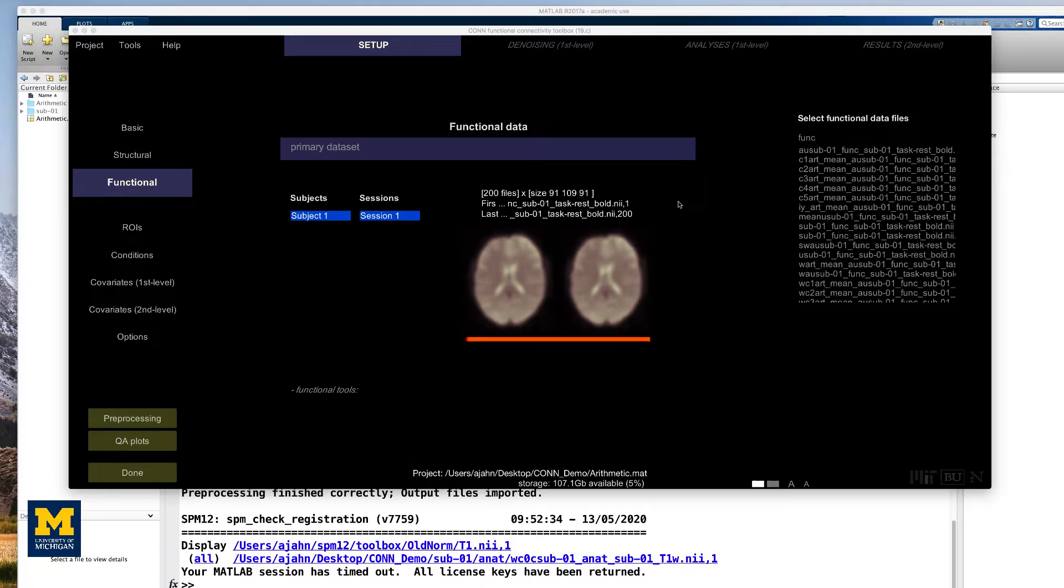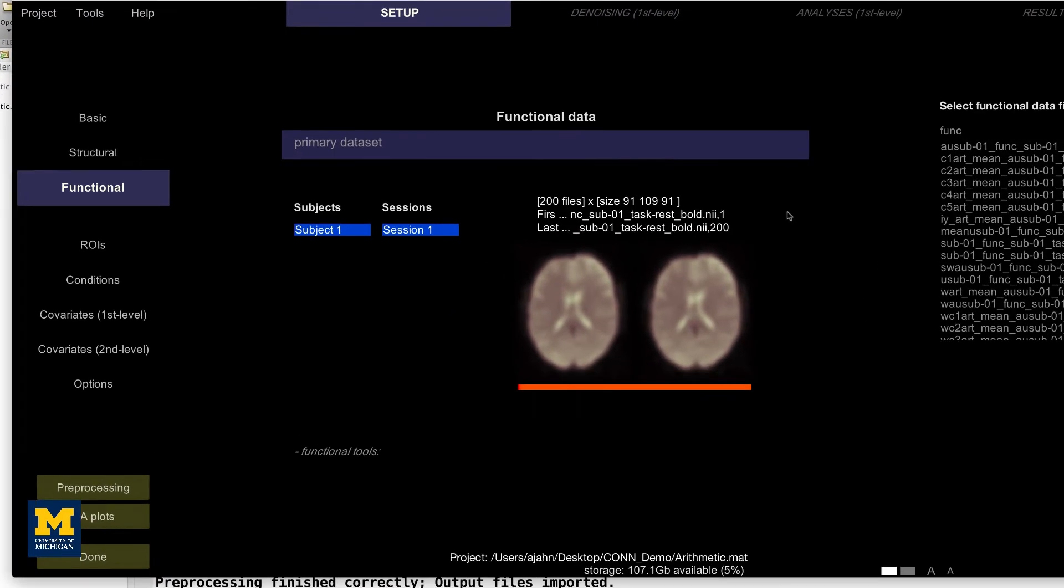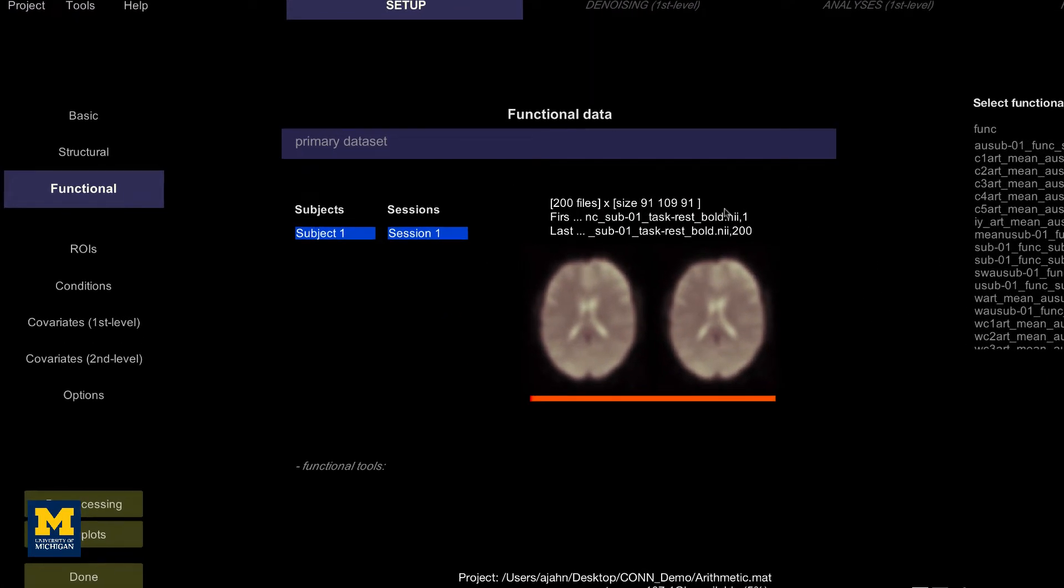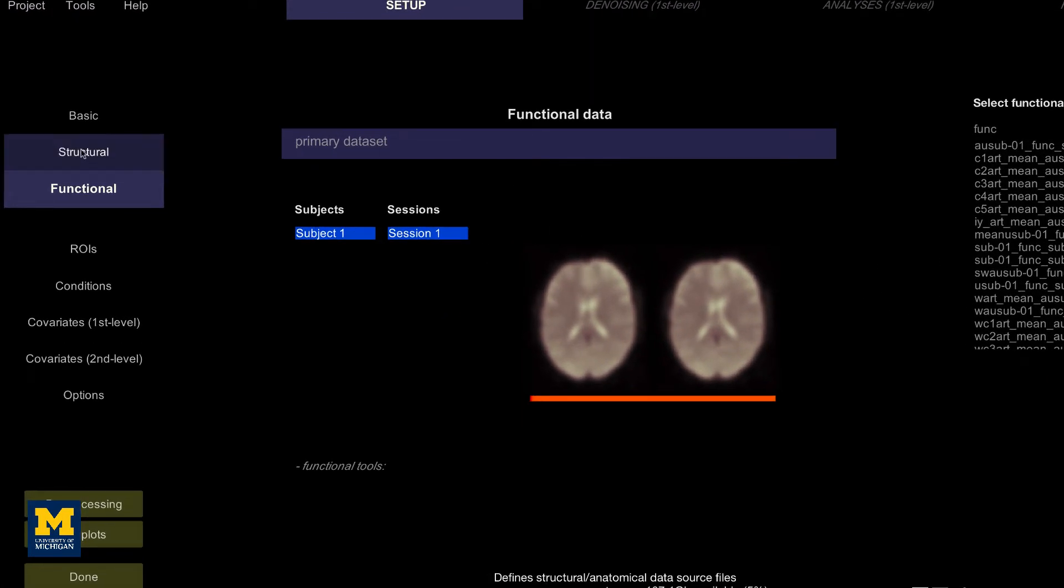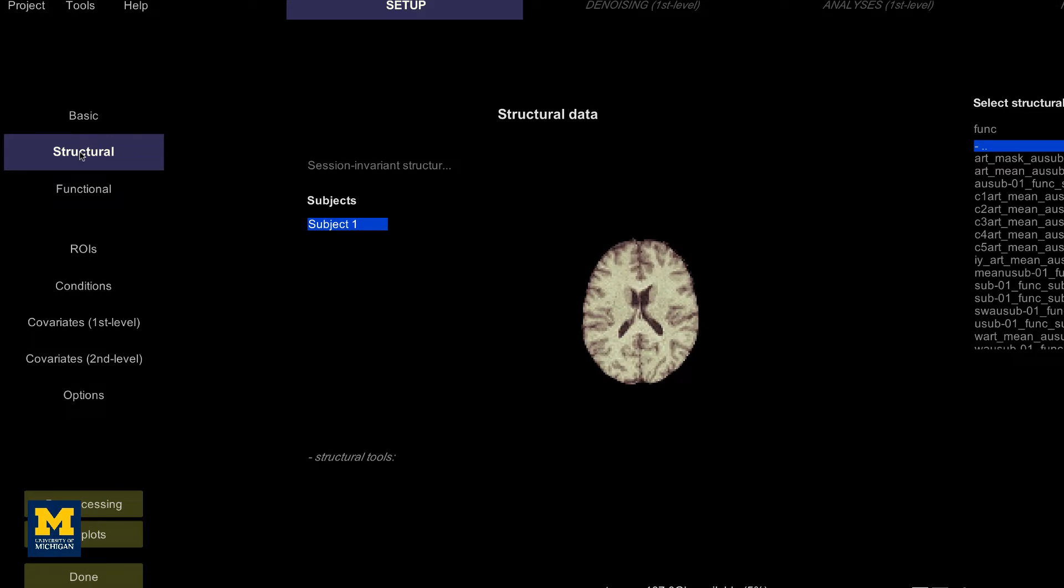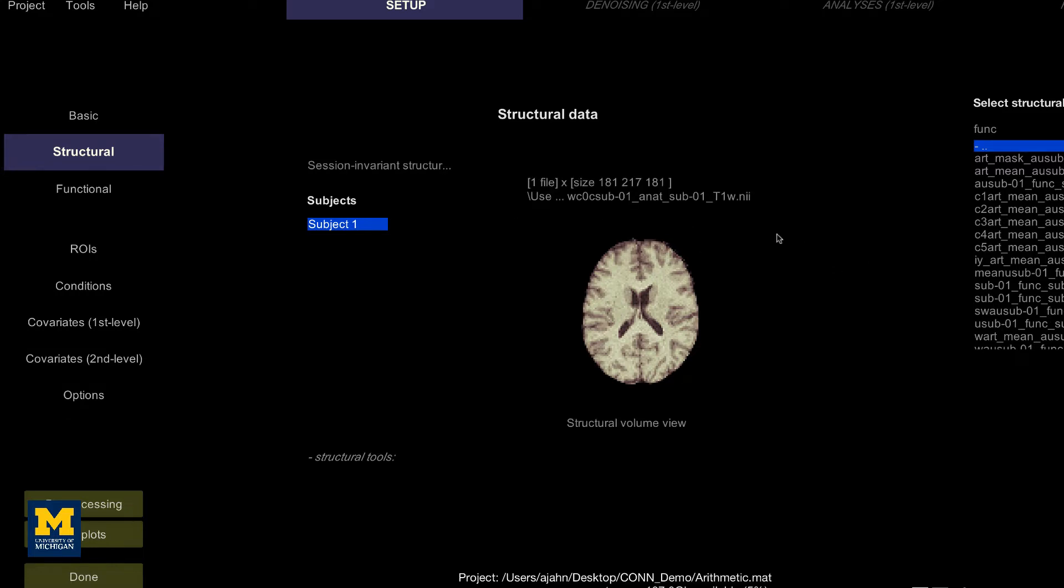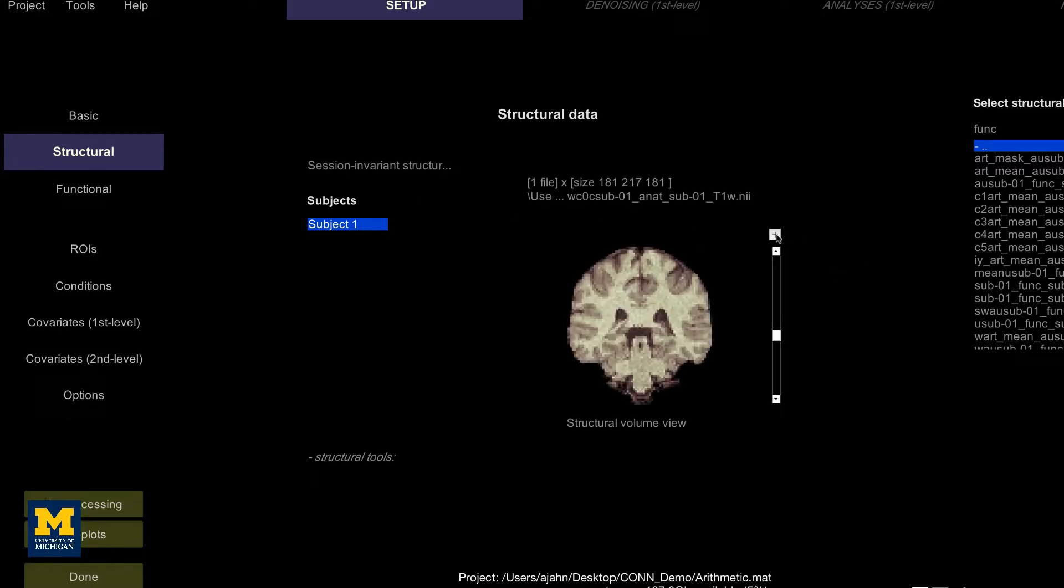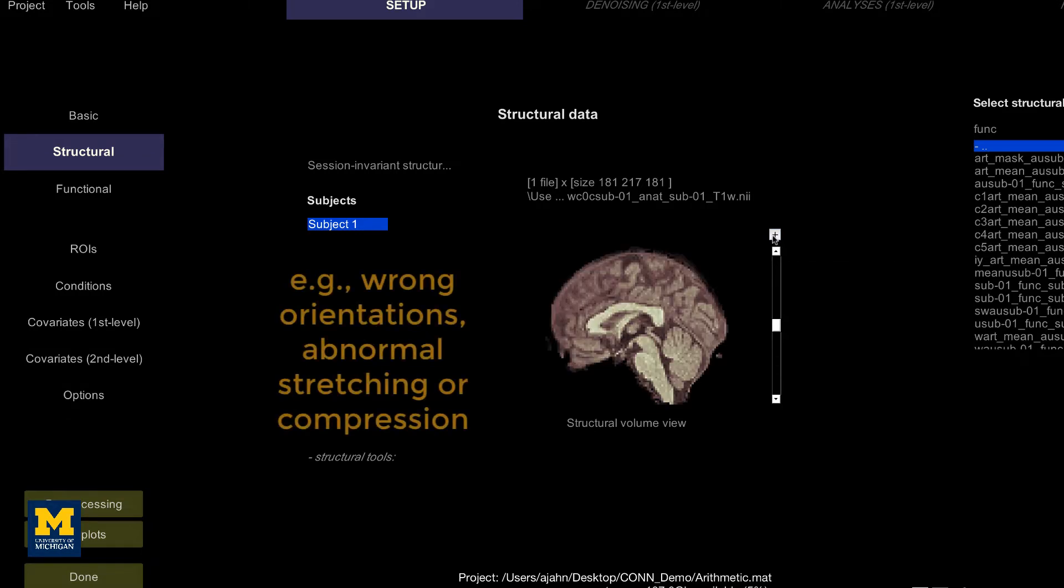Once the preprocessing has finished, click on the structural tab again. You will notice that the anatomical image looks different. In fact, it has been skull stripped, resampled to one millimeter cubic resolution, and normalized to match the MNI template.